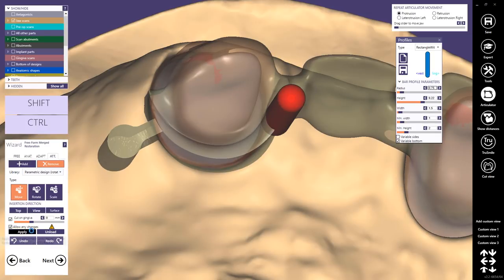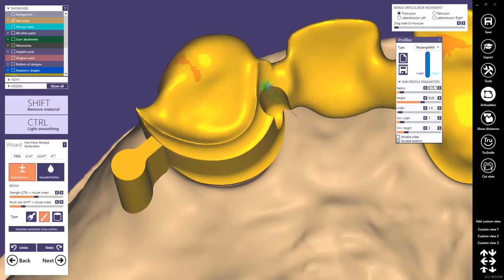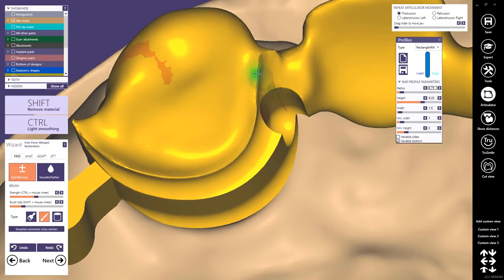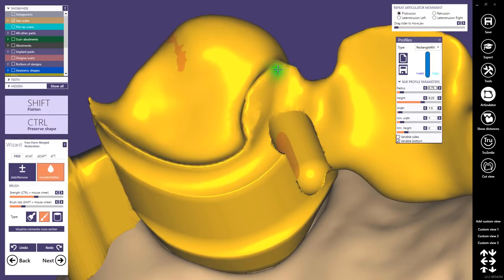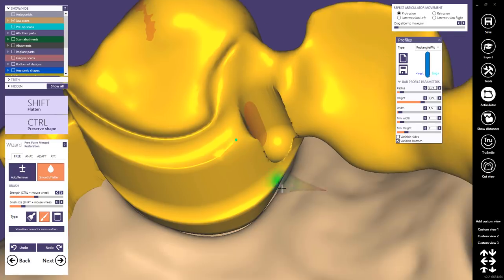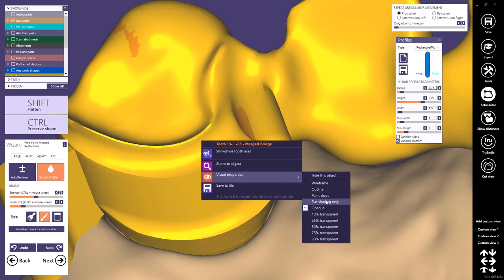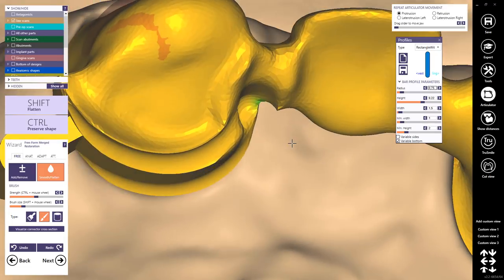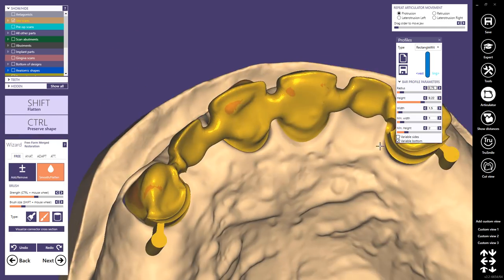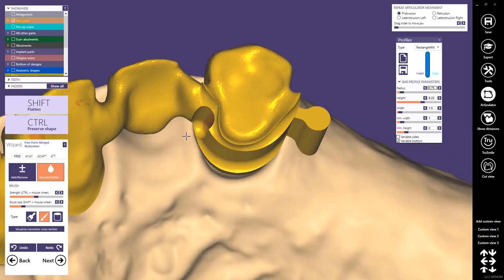Okay. Apply. And then again, we can go back to the freeform and do some fine tweaking, for example, at some material here, as this was not designed perfectly. Okay, still smooth it. You can even smooth the regions here. You can also use the flat shading, which I like here in this case. Then you see really how the geometry looks. Here I wouldn't touch it, it's perfect on this side.